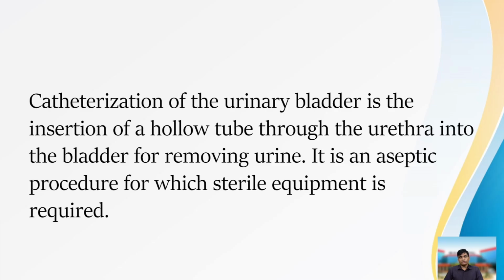Today I will discuss catheterization. Catheterization of the urinary bladder is the insertion of a hollow tube through the urethra into the bladder for removing urine. It is an aseptic procedure for which sterile equipment is required.